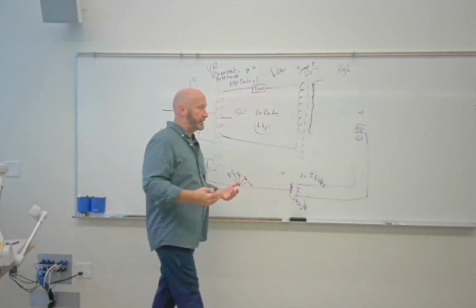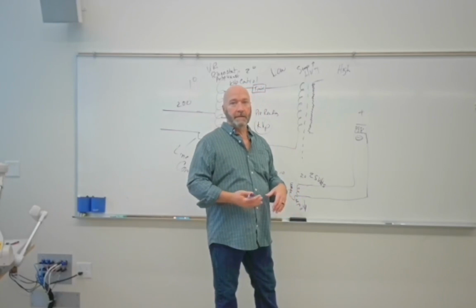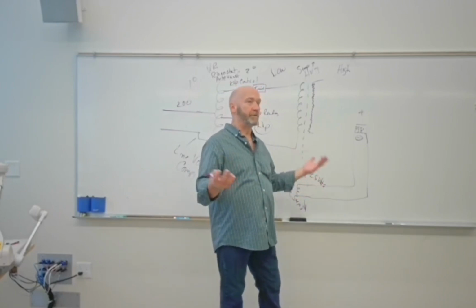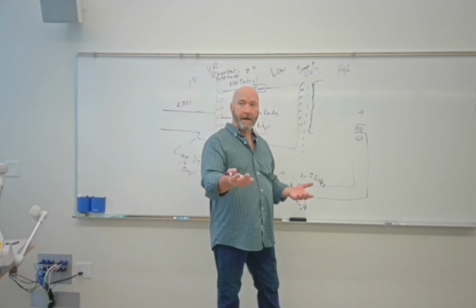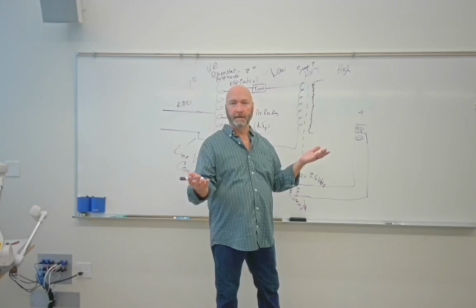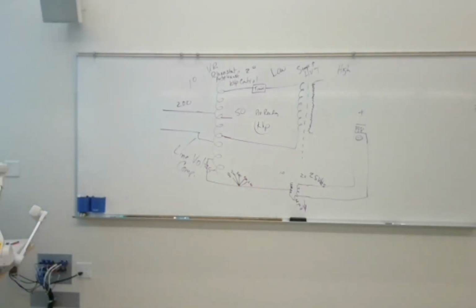Okay, and that circuit is there just to prevent that from happening, so that when you make your exposure, you get the proper amount of mass. Without that circuit, let's just throw numbers out there, you may set 10 mAs at 50 kVp and you get 10 mAs. You set the same mAs at 100 kVp and you may get 12, 15 mAs. Does that kind of make sense? So you don't want that, right? You want your mAs to be accurate. That's what that circuit is intended to do.